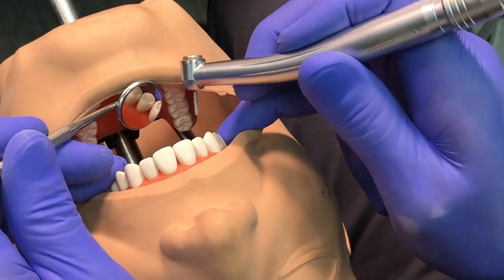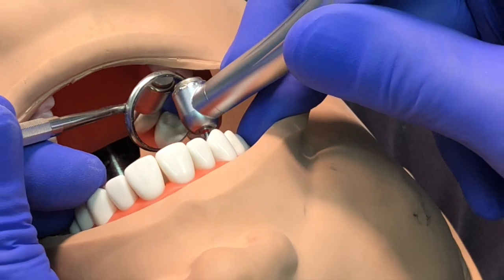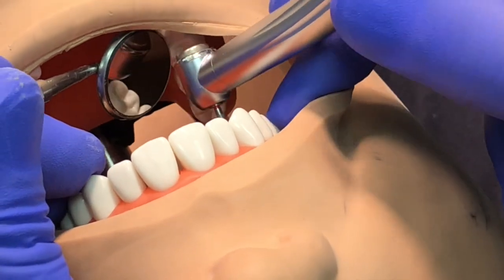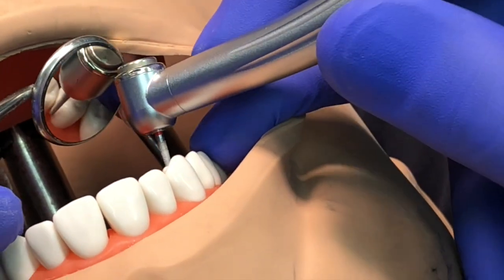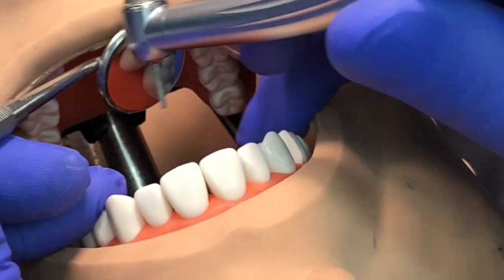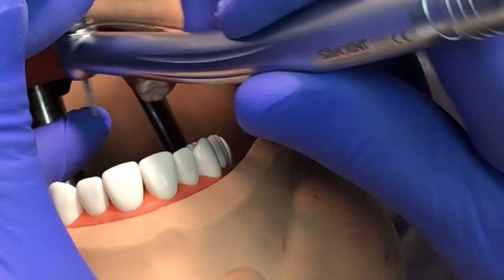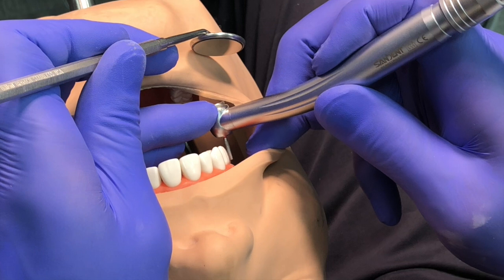Can I work on the lingual with this technique? I retract the cheek, place my finger on the buccal as a finger rest, use a modified pen grasp, and use the mirror. I can prep just fine — left is left, right is right. I can use it on the distal tooth and on the second molar. On the second molar, your finger rest will be anterior to where you're working. Generally I'll put my finger rest at about the first molar.